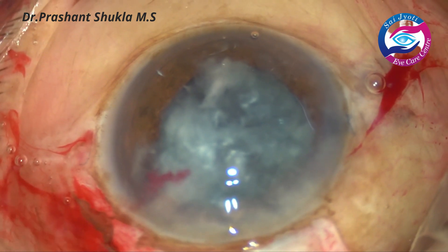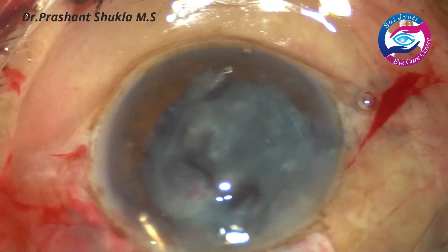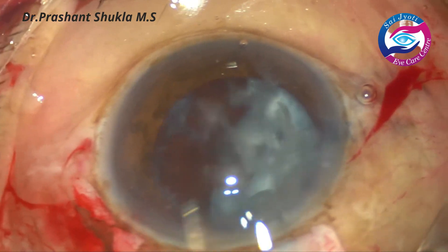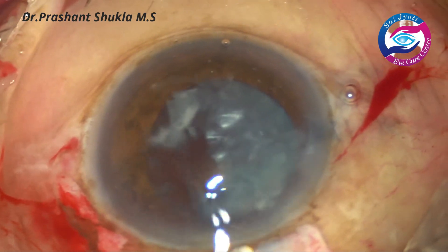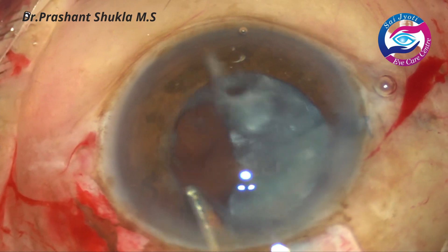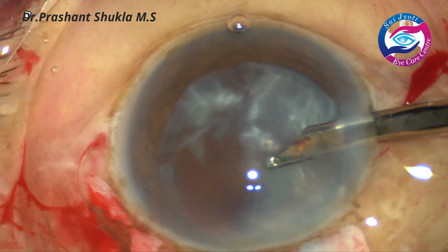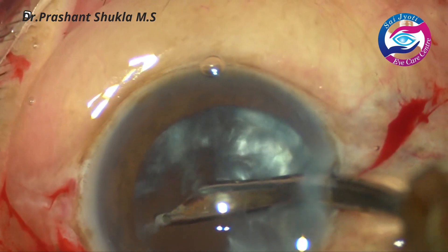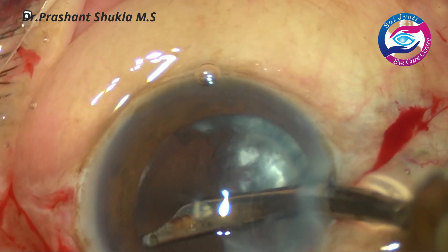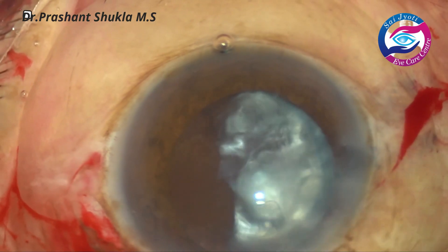After removing the nucleus, there is a lot of cortical matter. First the Simcoe is used just to irrigate out the cortex from the anterior chamber and the capsular bag — there is no aspiration used now, only the water jet. The same Simcoe is then used through the side port, where the chamber is formed very nicely and the cortex from the bag is removed.